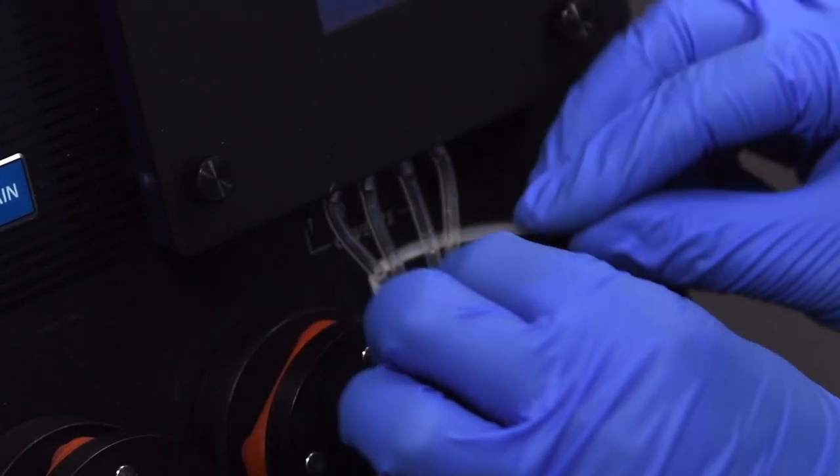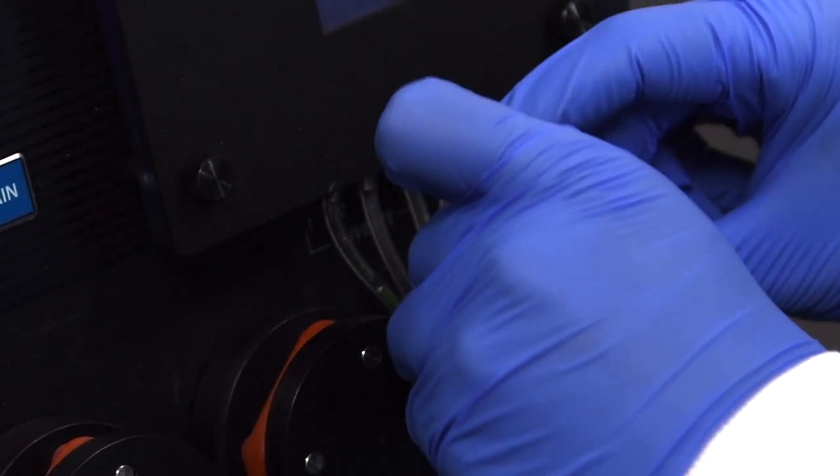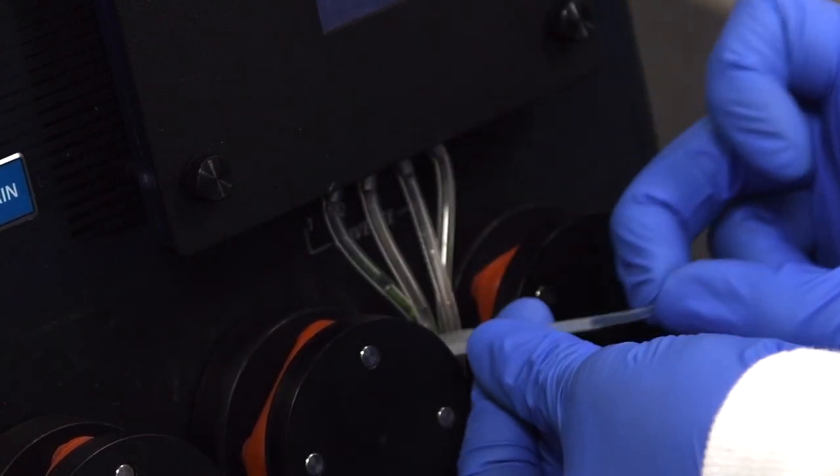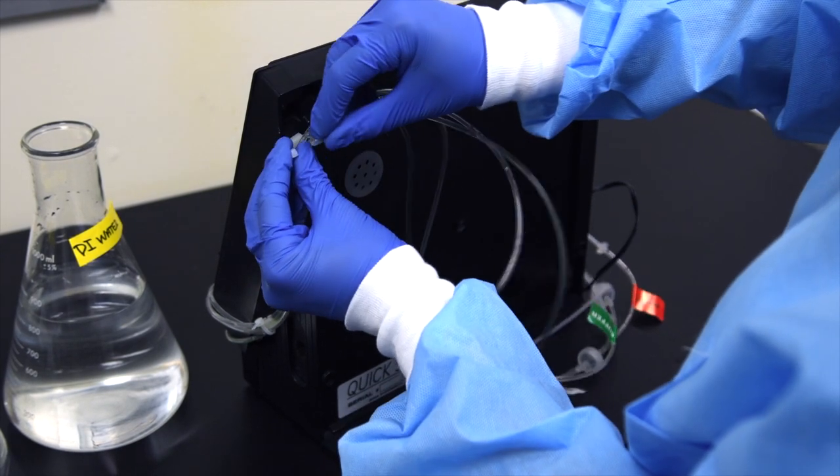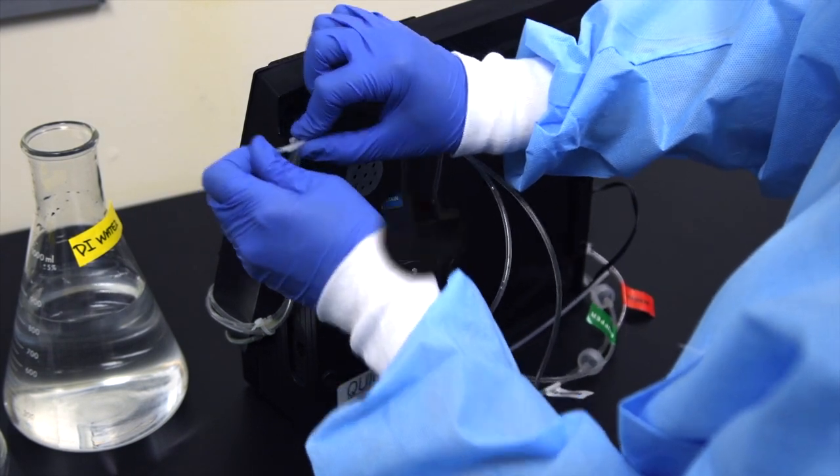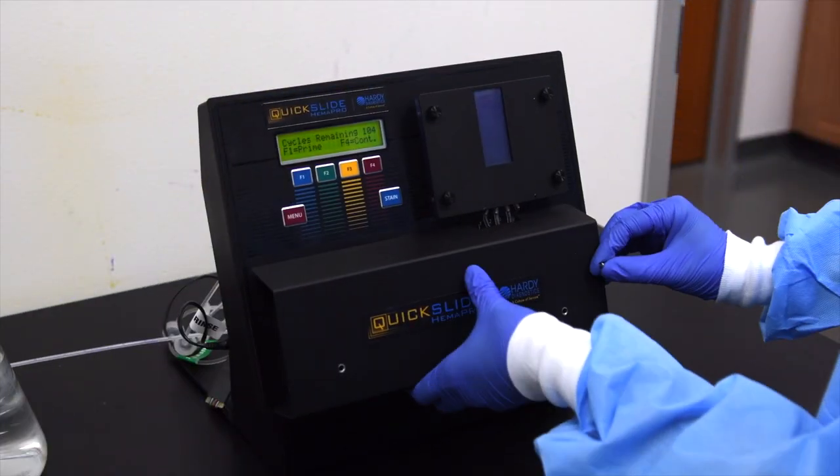Once the cannula lines are correctly installed, apply zip ties to the indicated places on the machine. This will ensure that the lines stay out of the way and can be contained neatly under the front panel. Now replace the front panel.